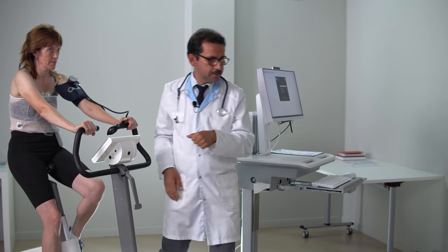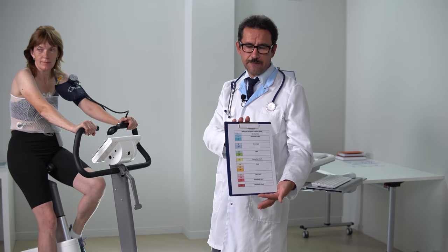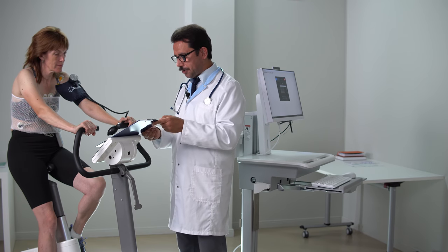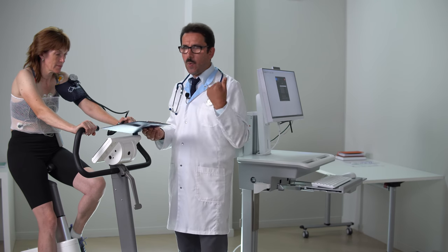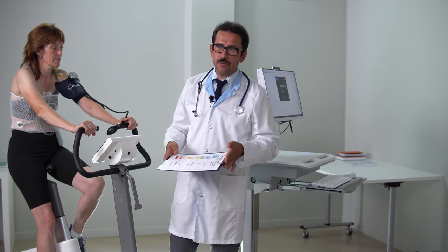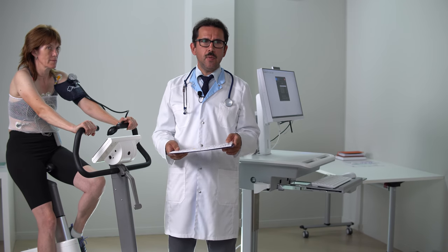And one more thing. Yes, this is the Borg scale. This one, I hope you know this stuff. The special chart, and during the test I will show this chart to my patient and ask to show the exercise level on this scale. Why is it important? During the test we have objective characteristics like workload, like heart rate, but it is also important to have the feelings of the patient.